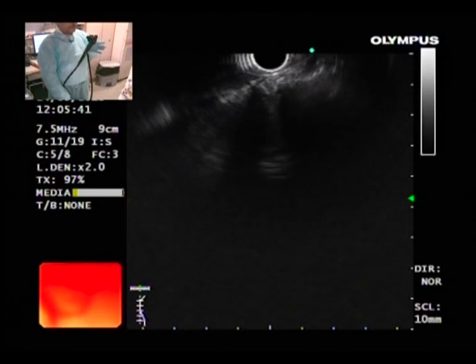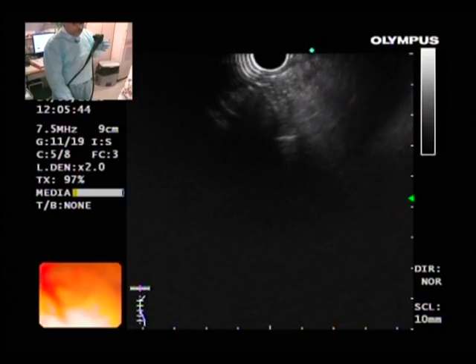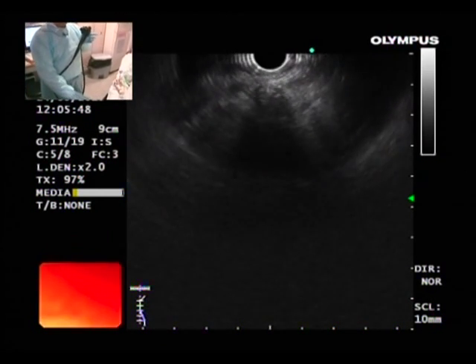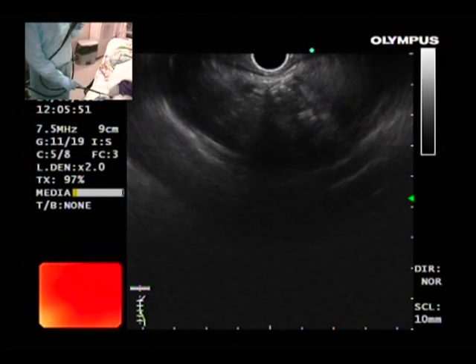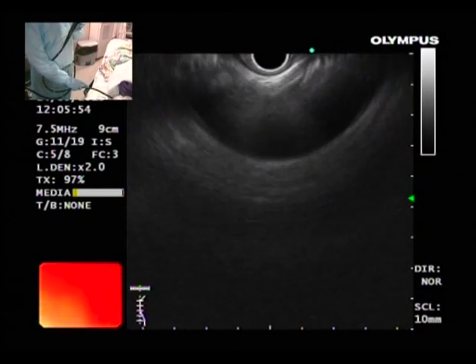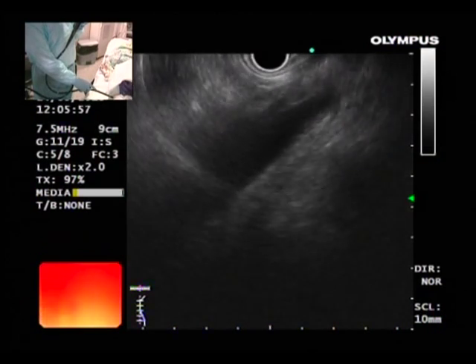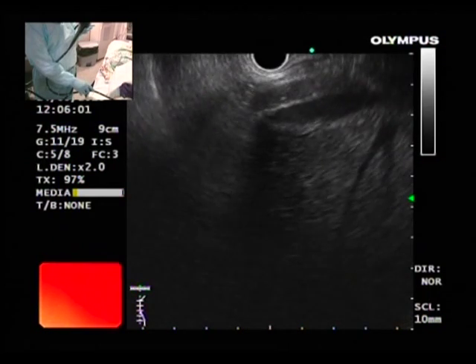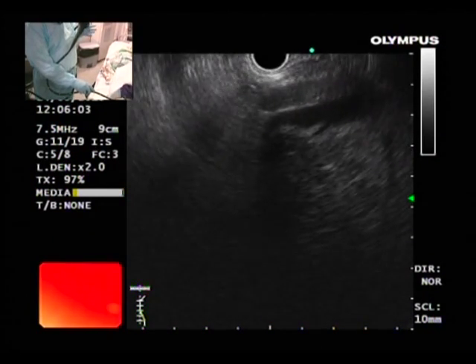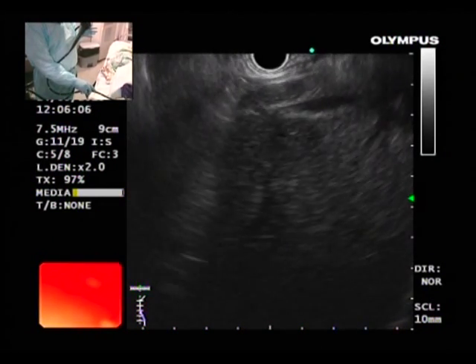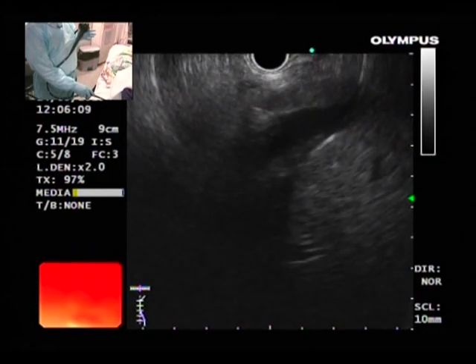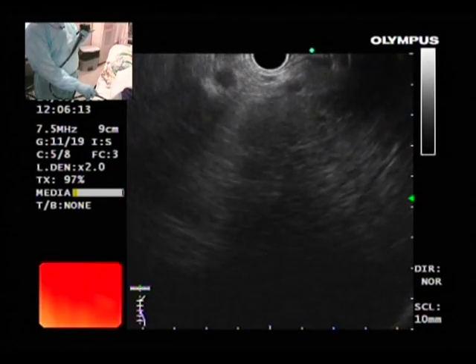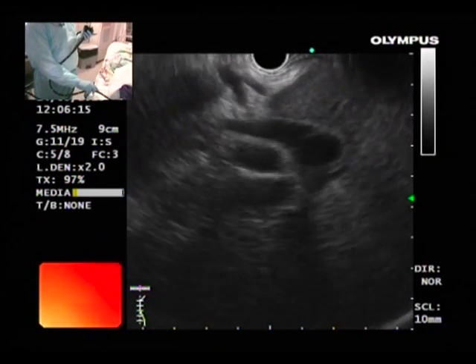So now I am in the anterior position. Let us go in and see what we are seeing. Going in straight, we should see the liver anteriorly. Yes, this is the liver and here is my scope. Look at my controls — they are very straight. This is the hepatic veins and IVC. If I go a little more anti-clockwise, I see the hilum. You can see the hilum of the liver.